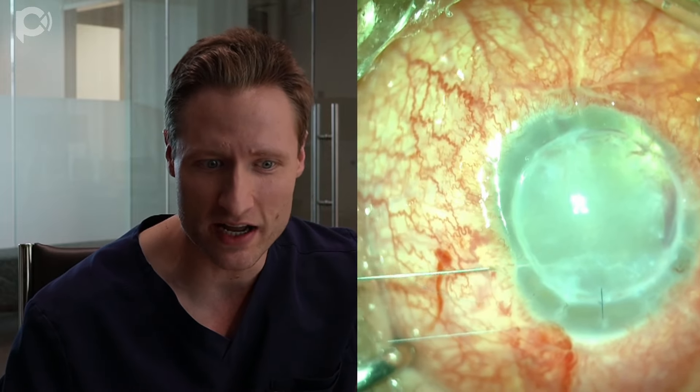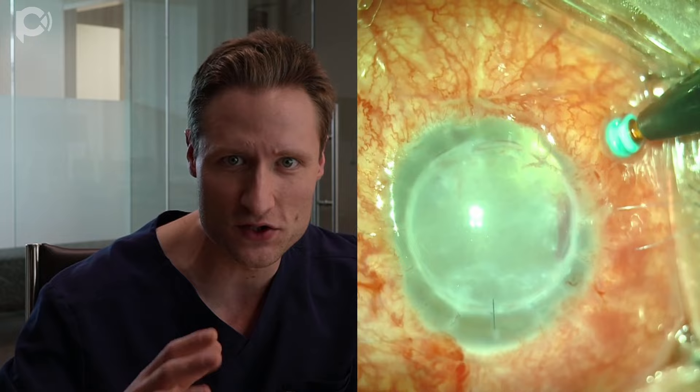I'm starting the case by putting a chandelier illuminator into the pars plana and then stretching this cat's cradle network of prolene suture across the anterior chamber. The reason is that with no iris diaphragm at all and no lens in the eye, when you inject the DMEK graft, it's just going to fall directly back into the back of the eye. So in order to prevent that, you can create a little meshwork of suture — a web — to unfold the graft on top of.